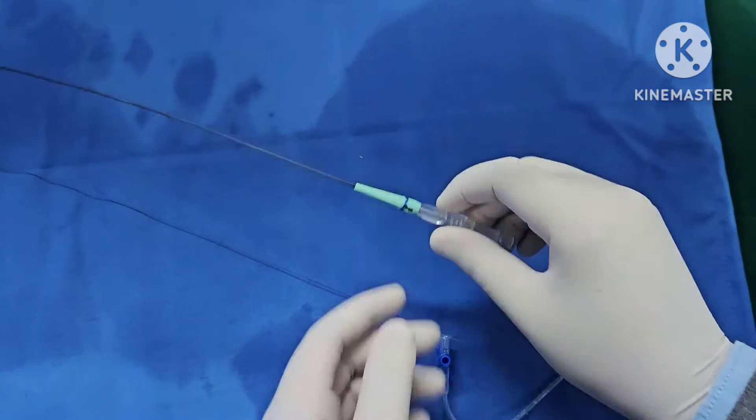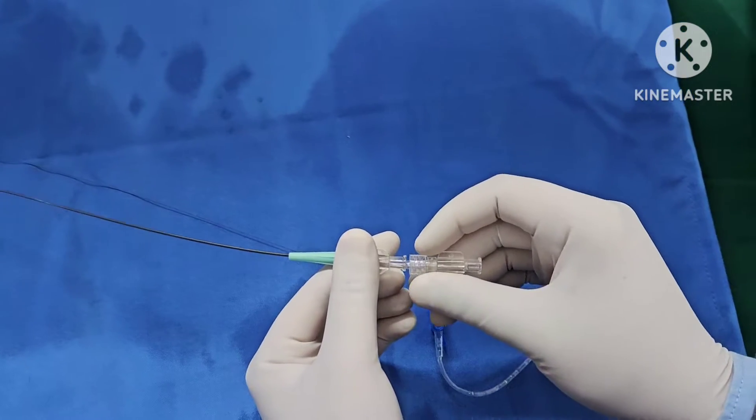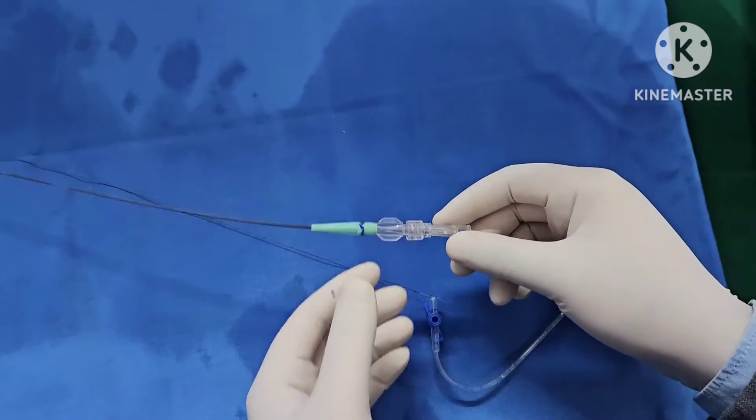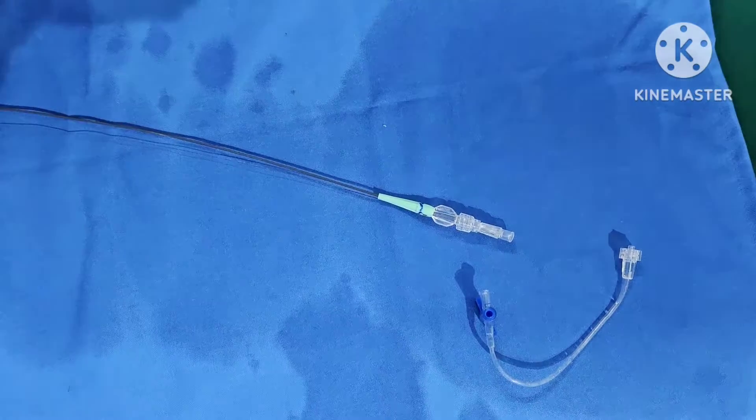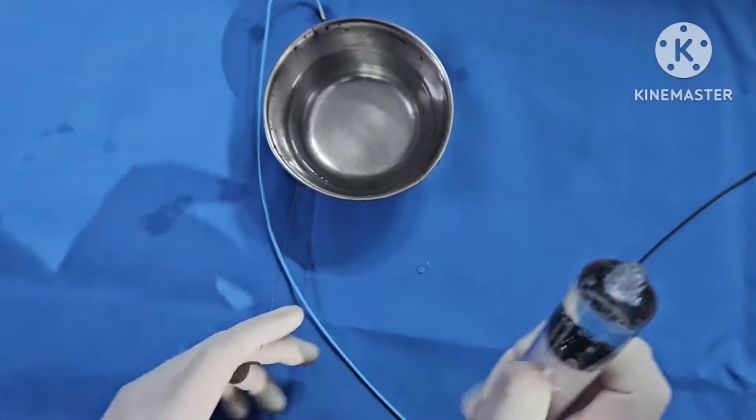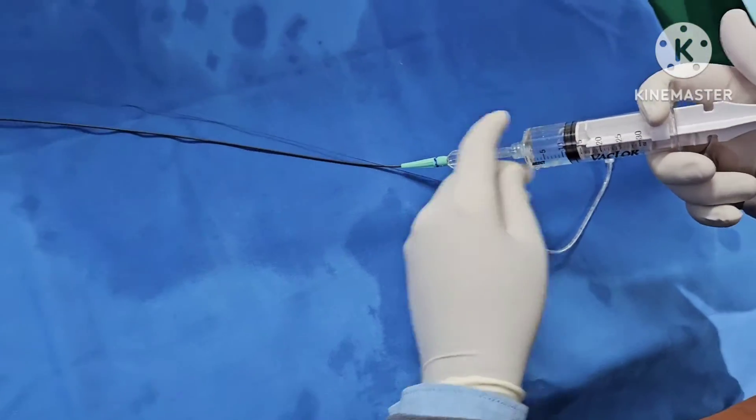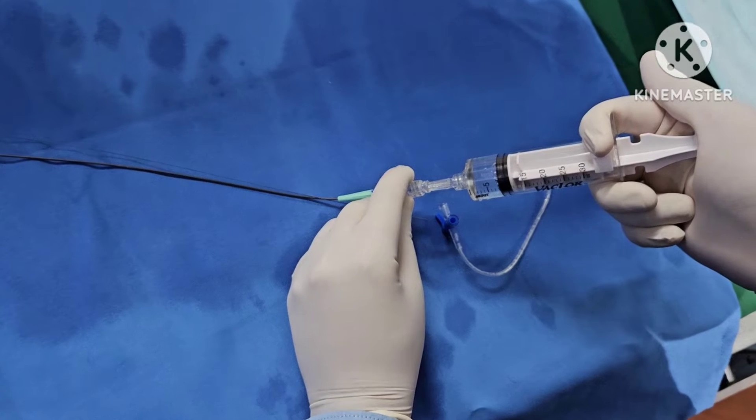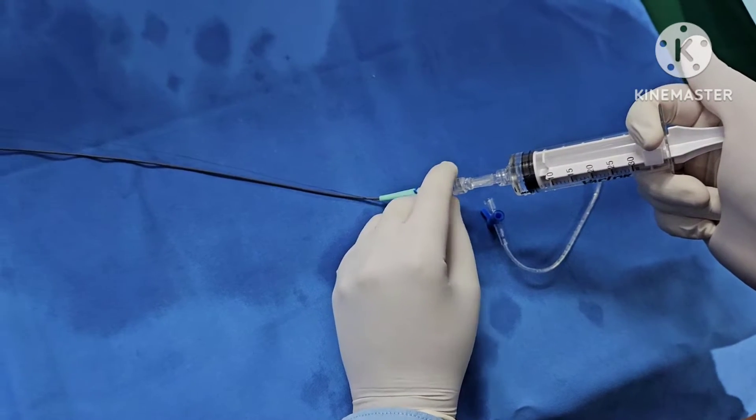So the thrombus aspiration catheter, the stilet is already in place. You can see that the stilet is inside. So we insert the thrombus aspiration catheter with the stilet in place. So first of all, what we have to do is we are going to take 5 to 10 ml of heparinized saline and we are going to flush the catheter once. And we will be inserting all of this heparinized saline so that the catheter gets flushed adequately.